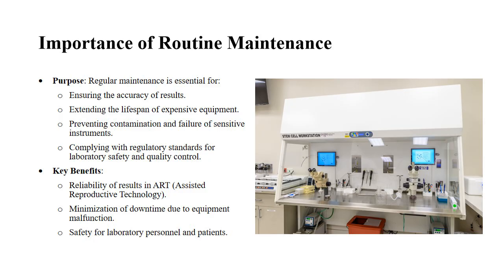Contamination prevention: cleaning and sterilization reduce the risk of cross-contamination between samples, reagents, and embryos. Regulatory compliance: laboratories must adhere to safety and quality control regulations to meet industry standards, e.g., ISO, FDA. Second, routine maintenance of embryology laboratory equipment.